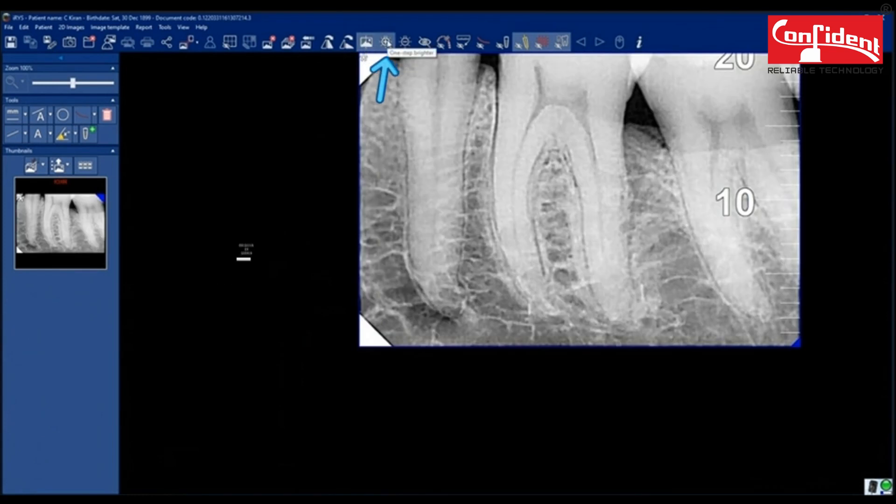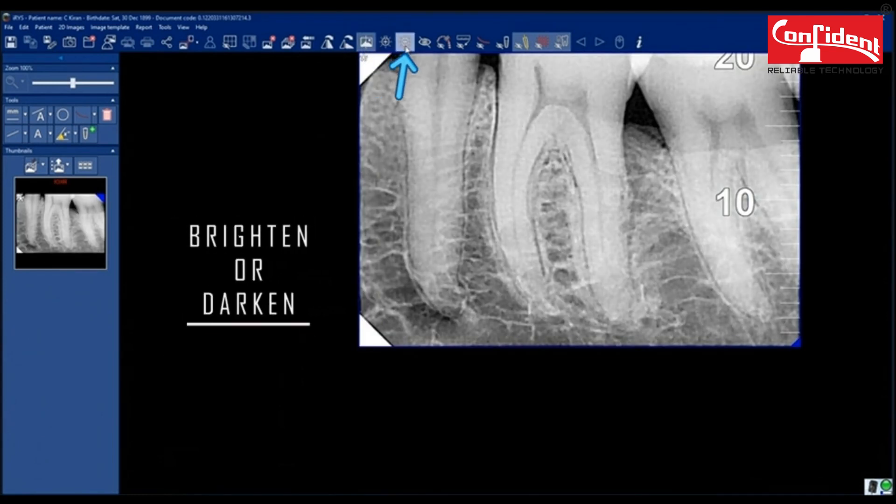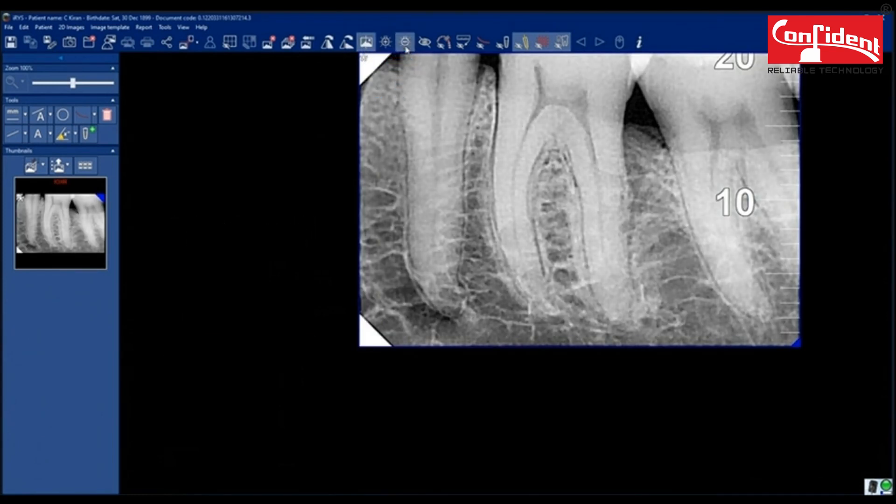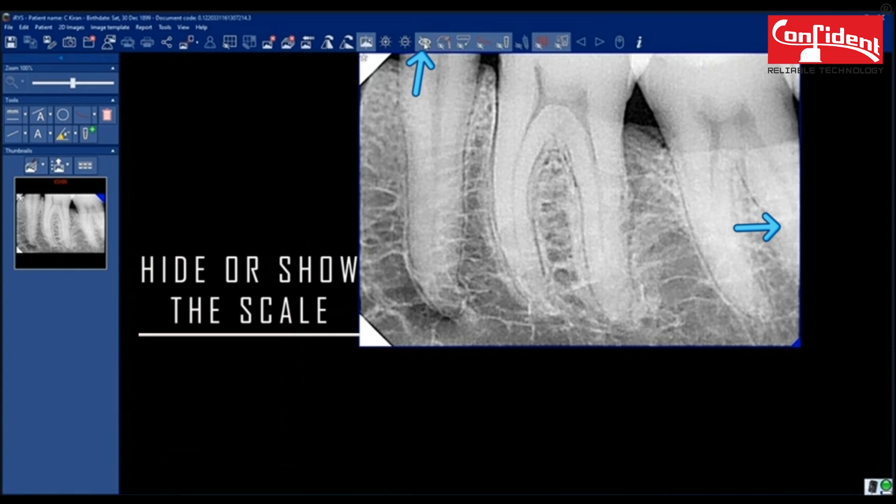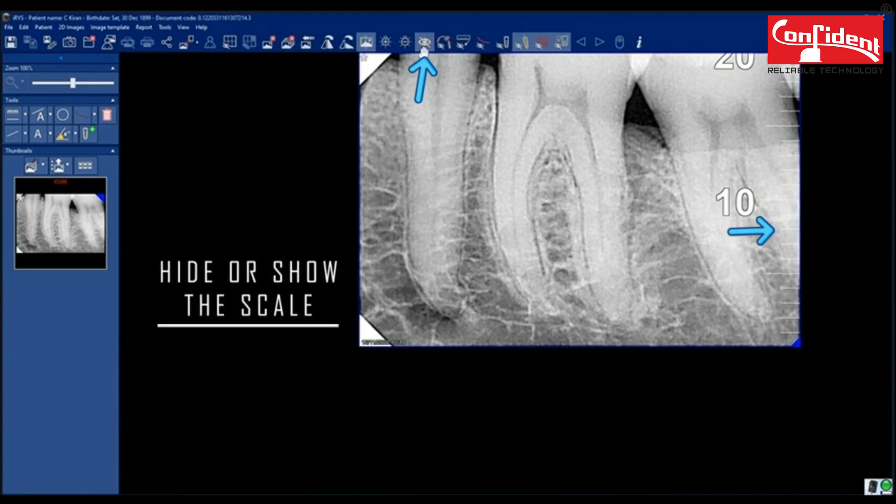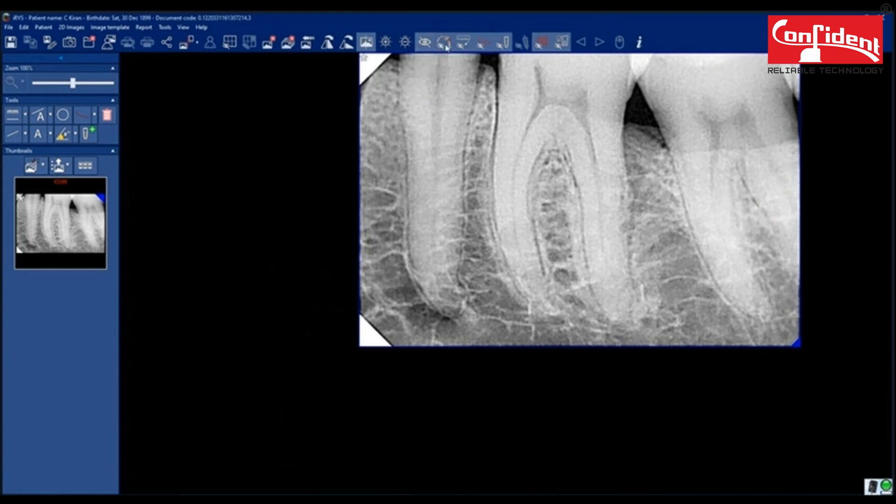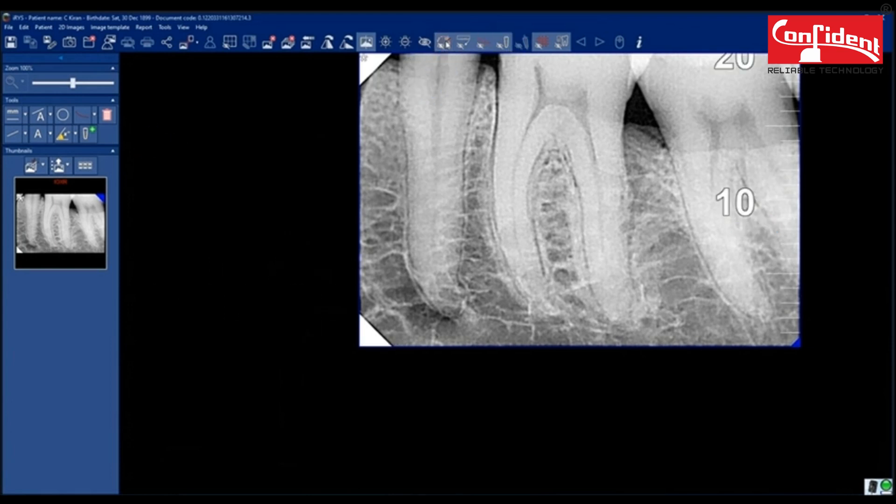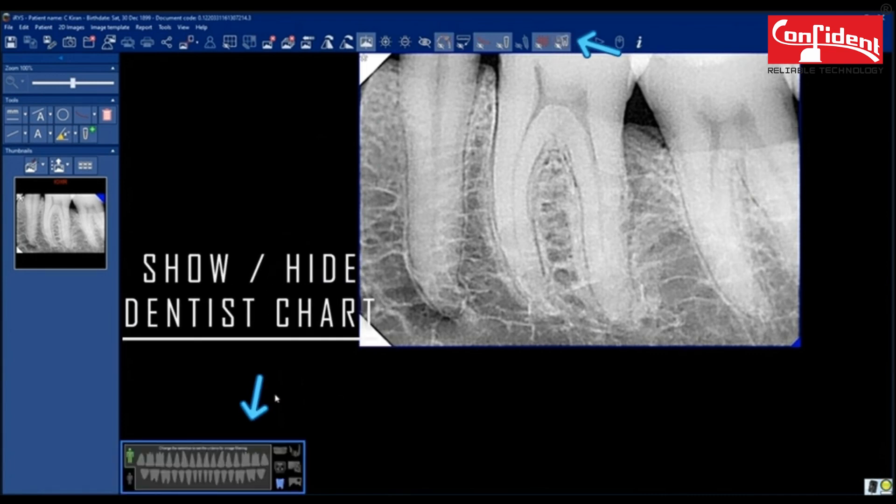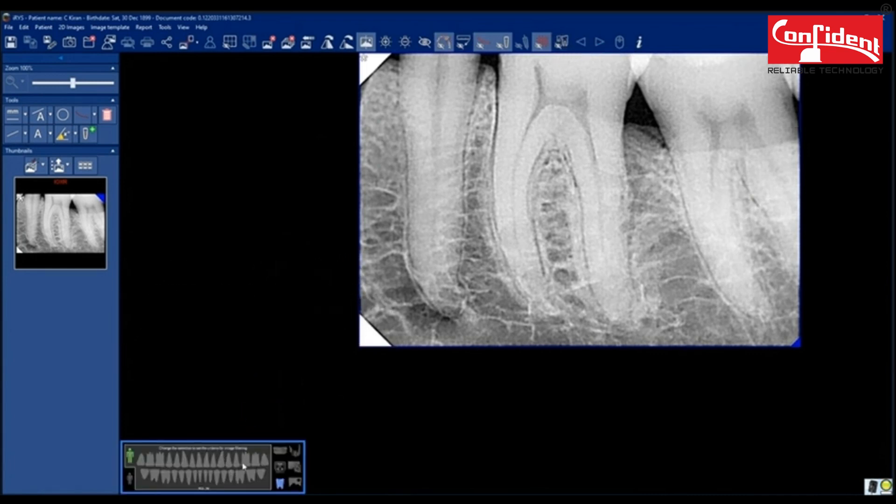Click here to brighten by one step or darker. Hide or show the scale by clicking here. Show or hide image editing tools by clicking on this icon. Click here to show or hide a dentist chart.